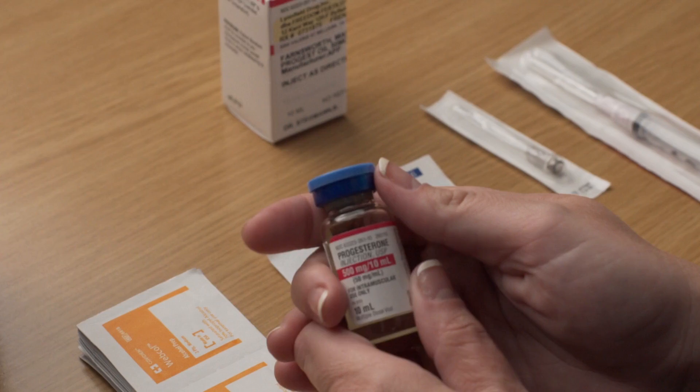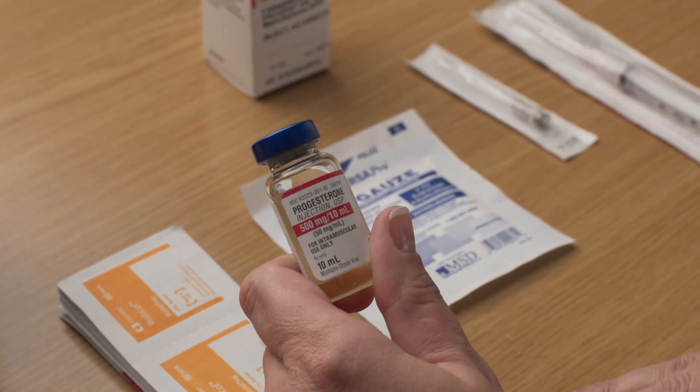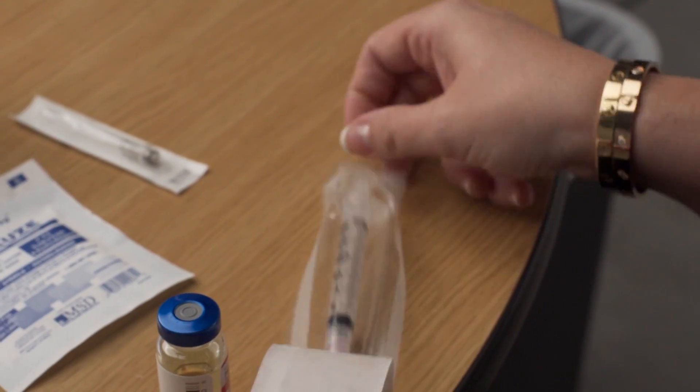If using the vial for the first time, use your thumb to flip the protective plastic cap off the vial of progesterone in oil. Wipe the top of the vial with an alcohol swab each time you draw progesterone from the vial. Remove the wrapping from the syringe.